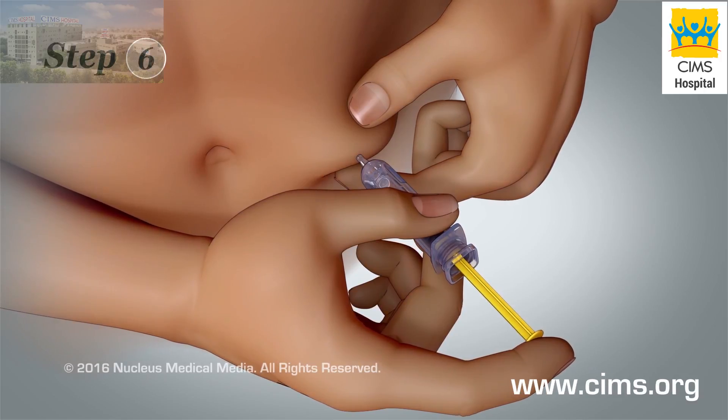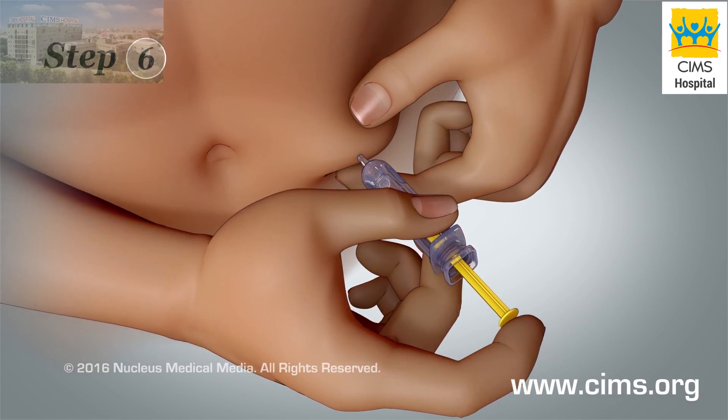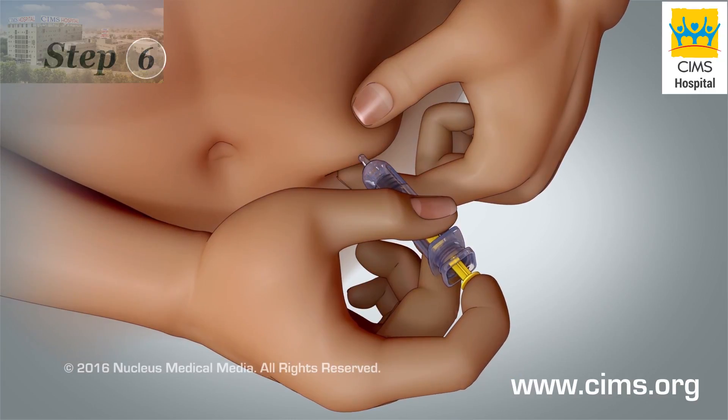Step 6. Slowly press the plunger to deliver all of the medicine, including the air bubble.